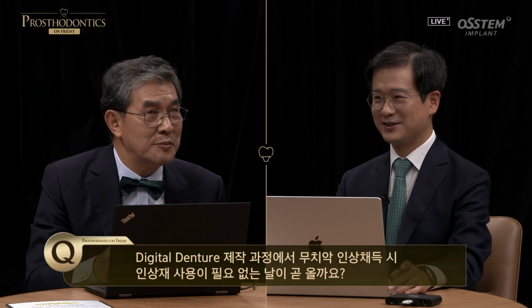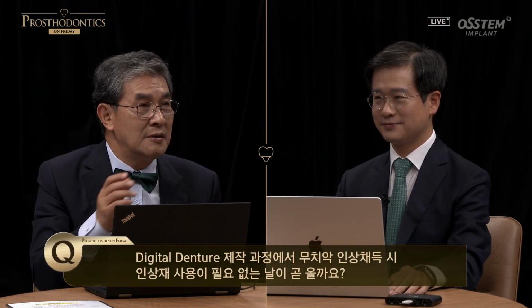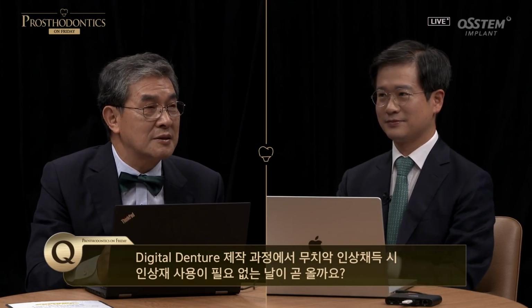Yes. So my question is also, when you scan orally, setting the border is always the difficult part. So you're saying even if that area is short, if it's very accurate, then retention and stability will still be okay, right? Yes, digital processing makes it all accurate. That's the assumption. But it will take time for us to get there, right? Maybe sooner than you think. Okay, then I will look forward to that.